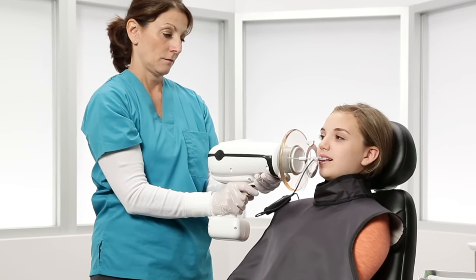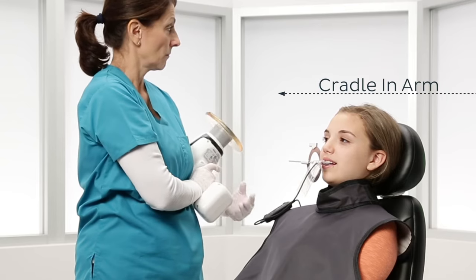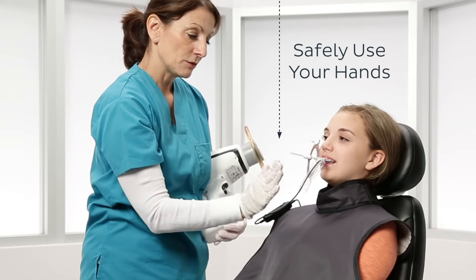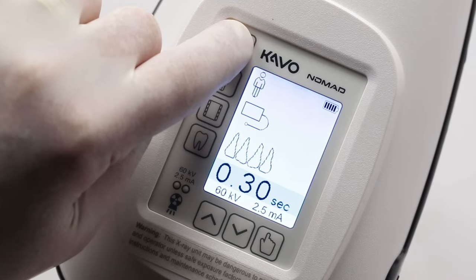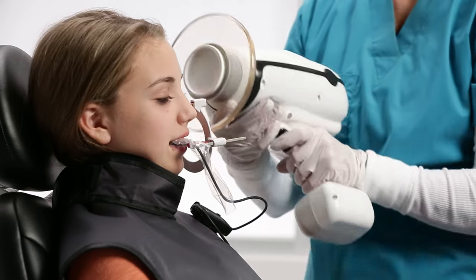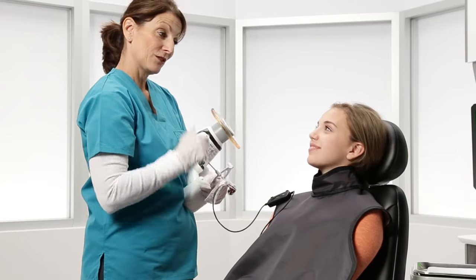In between exposures, you can either set the Nomad down or cradle the device in one arm. Cradling allows you to safely use your hands while positioning without having to put the Nomad down. To power off the Nomad, press and release the power button, or the Nomad will automatically turn off after approximately three minutes of inactivity. Congratulations! You've completed this short safety video for your CAVO Nomad Pro 2. Thank you!